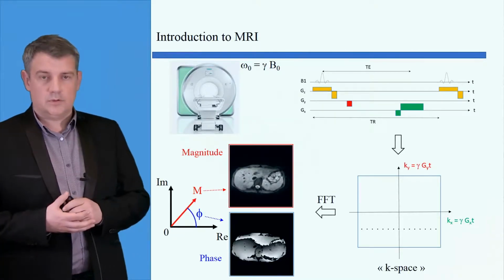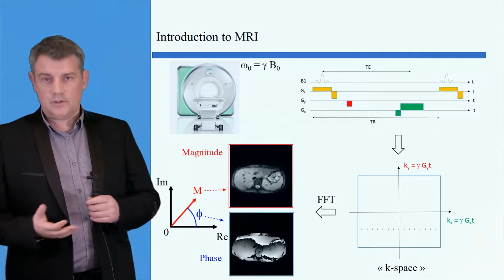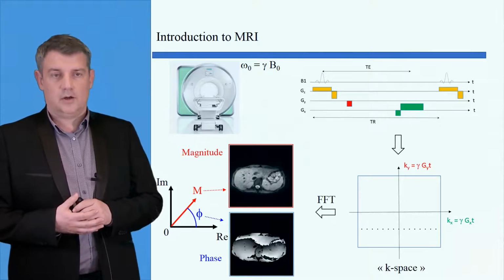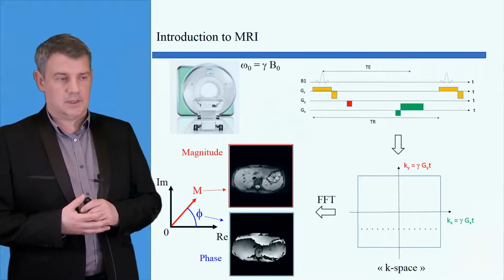So the purpose of this talk is to try to convince you that MRI can achieve this and to present you methods on how to monitor the temperature change using this technique.